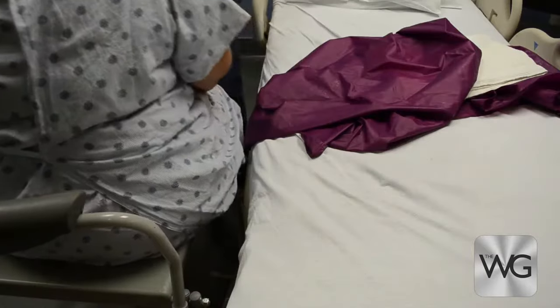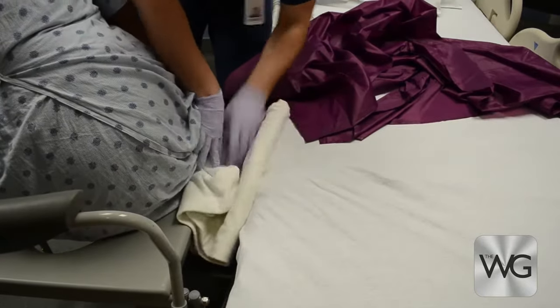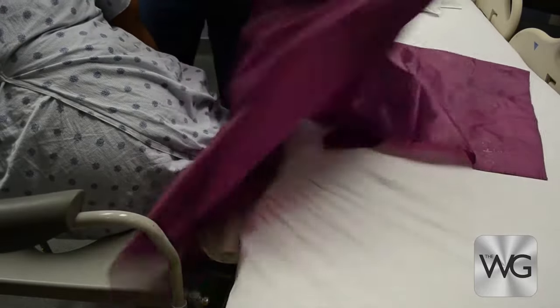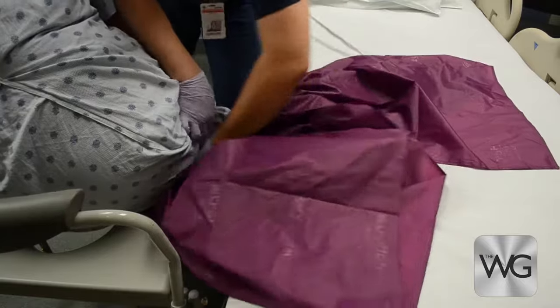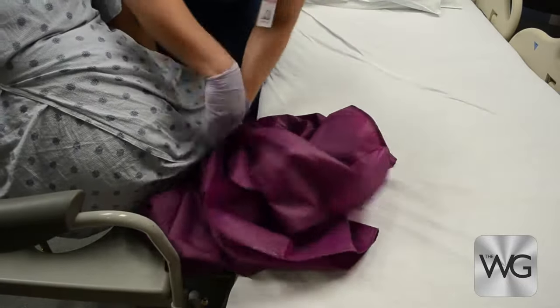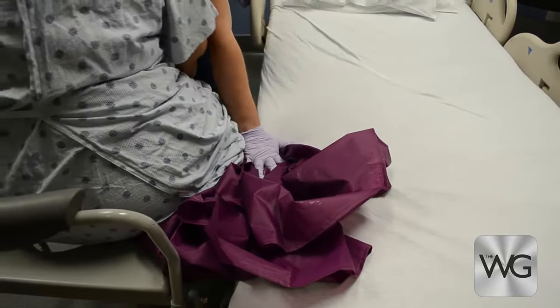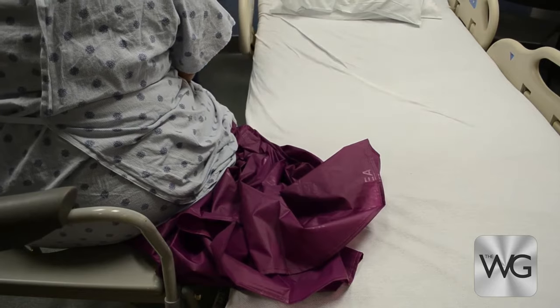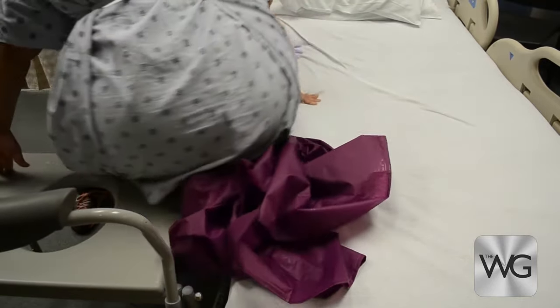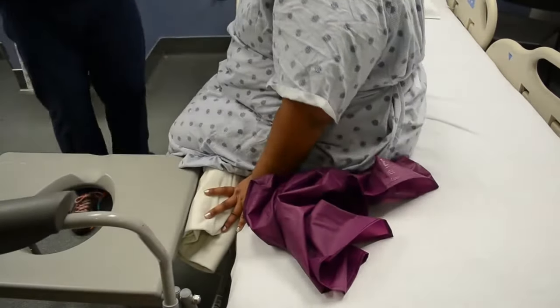When transferring back to bed, remove the armrest of the commode and bridge the gap between commode and bed just as before. Take a single slide sheet, fold it in half, and tuck it under the patient's bottom and thigh just at the edge of the commode. Be careful not to place the slide sheet in the commode. Ensure the bed is slightly lower than the bedside commode and the patient is transferring downhill. Assist the patient near the hip or pelvis to transfer from commode to bed.